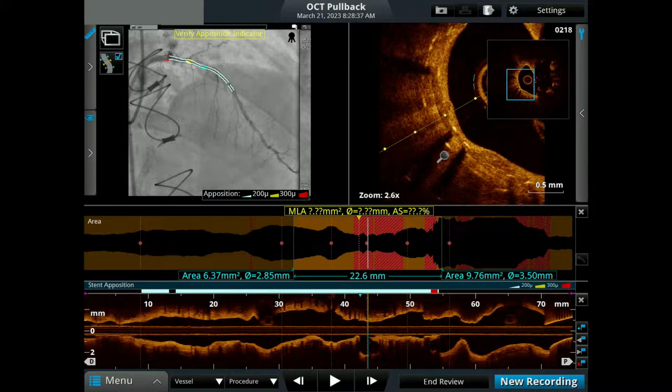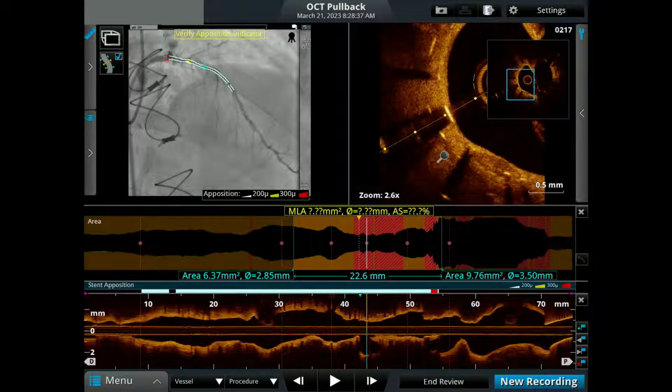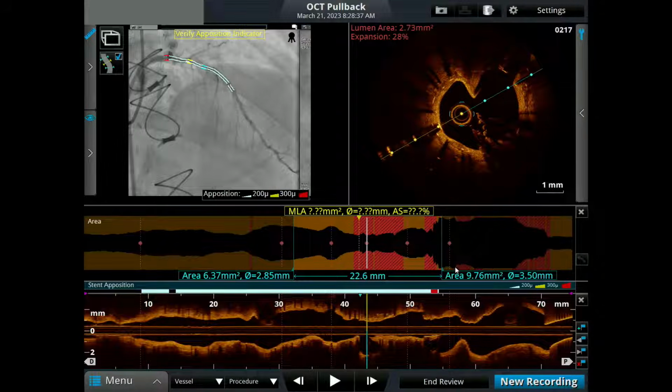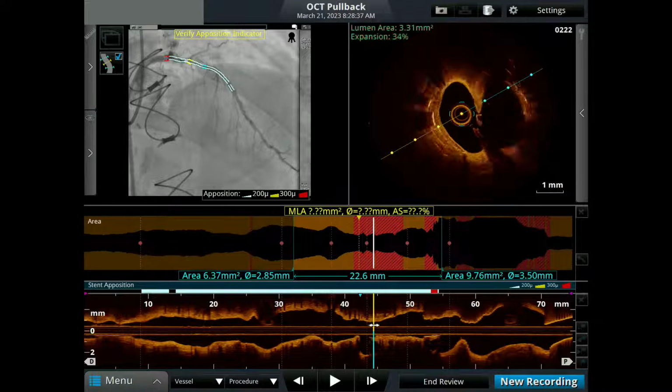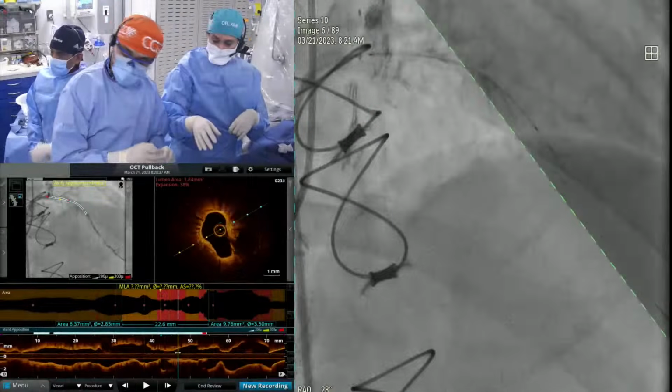So what we think, there was an original stent in the LAD, and then we did SKS of the LAD diagonal. So double layer, and see the nice 2 dumbbell. Those are the classical hallmark of the SKS, simultaneous kissing stent with the center carina. So we created the first separate carina and now the carina is endothelized. And then we published that you see a white shadow.